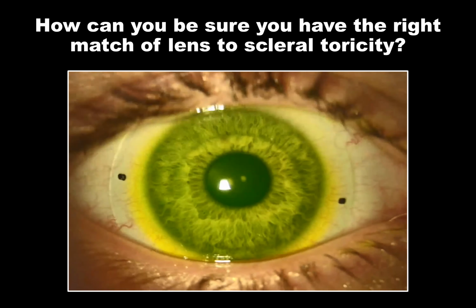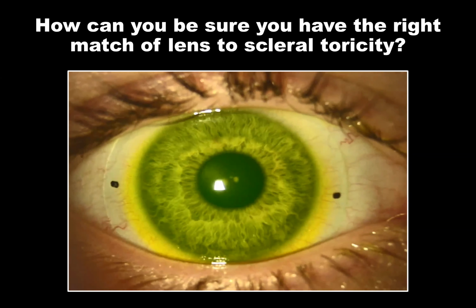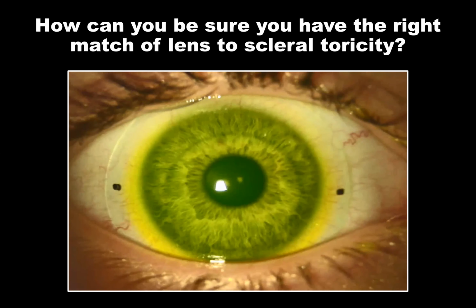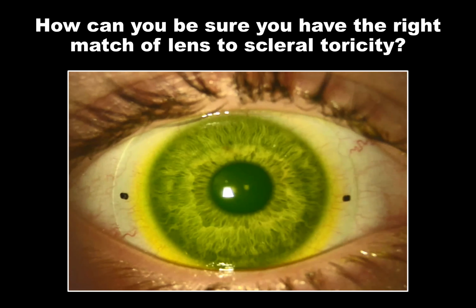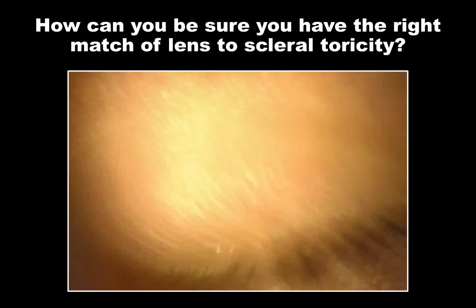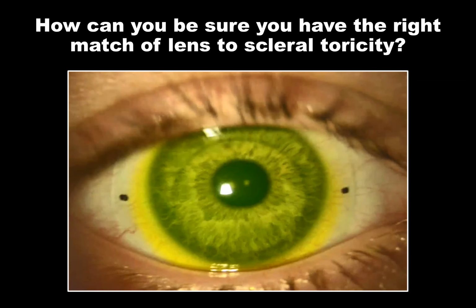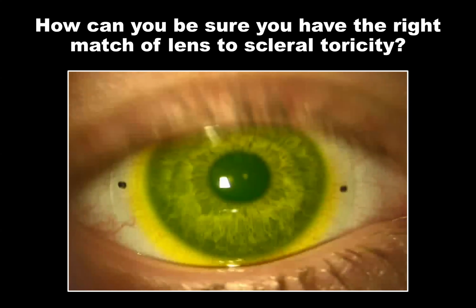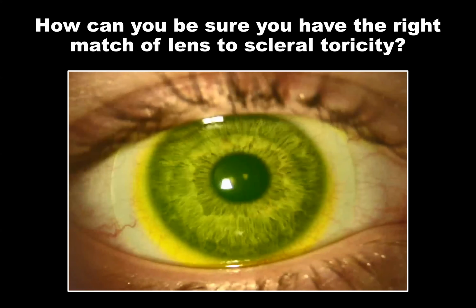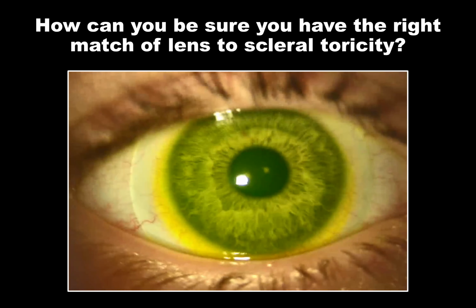When we ask about the comfort scale of the symmetric versus the toric, patients may say the symmetric is 8, 8.5, and the toric is 8.5, 9. So it's incredibly small, the difference in comfort, but it's enough that it's noticeable to a wearer. So I think you will find by fitting more toric landing scleral lenses like the SmartLens, that initial comfort may be just a tiny amount better than it would be in a symmetric.